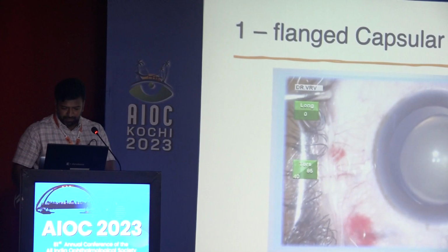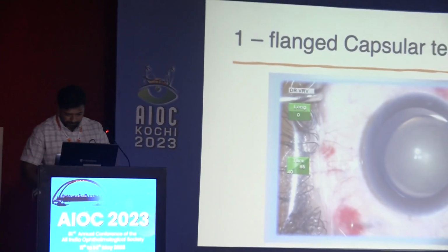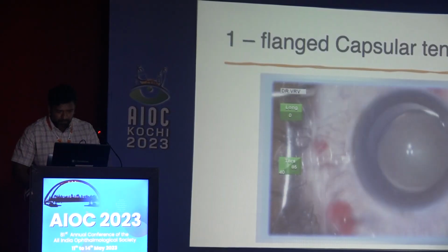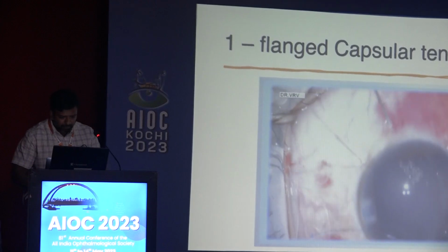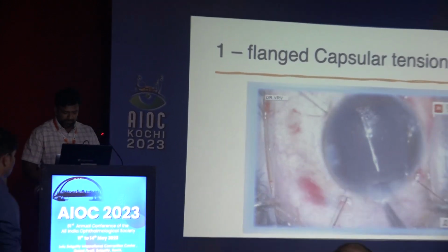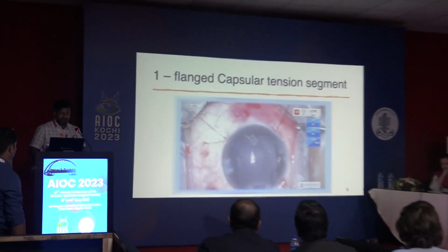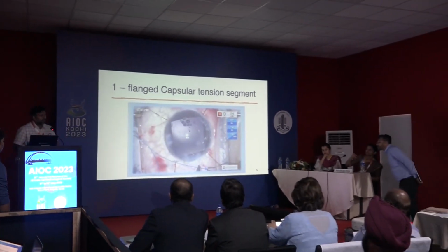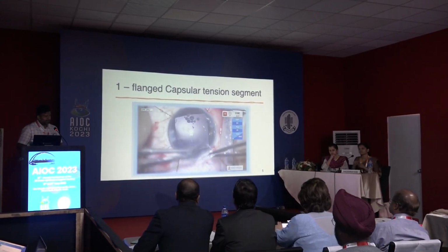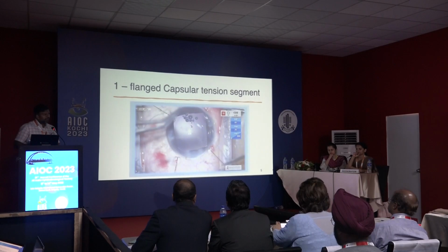This is a case of microspherophakia where capsule hooks are placed and phacoemulsification is done. Then instead of making a peritomy and Hoffman's pocket or a scleral flap, the 6-0 or 7-0 Prolene suture is threaded through the needle and exteriorized.